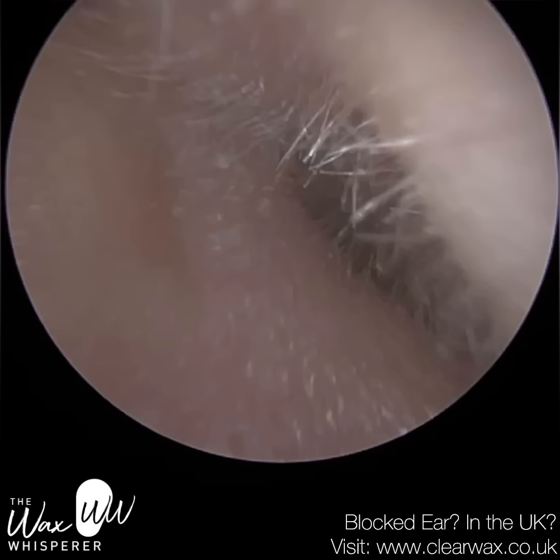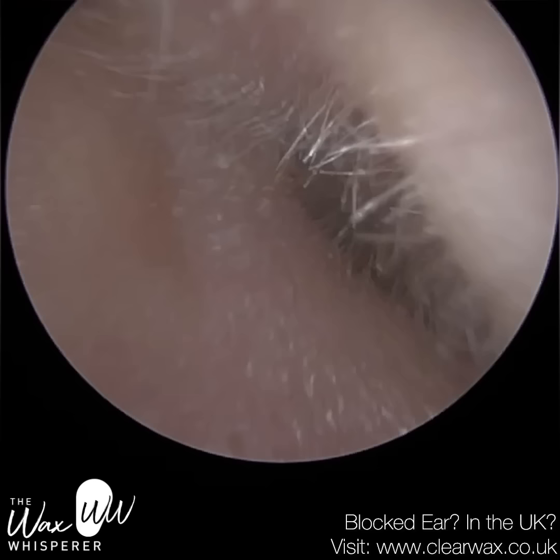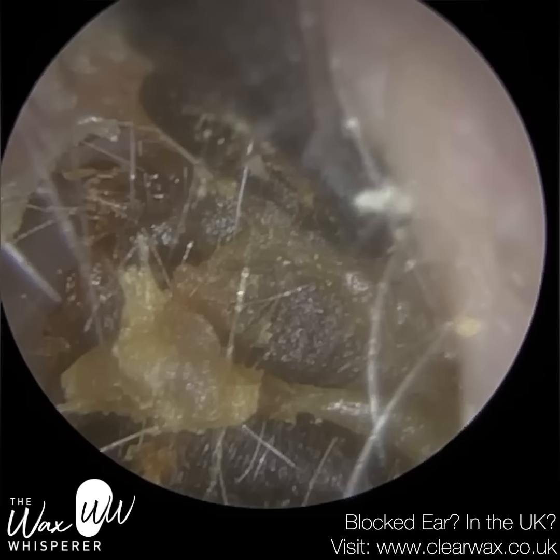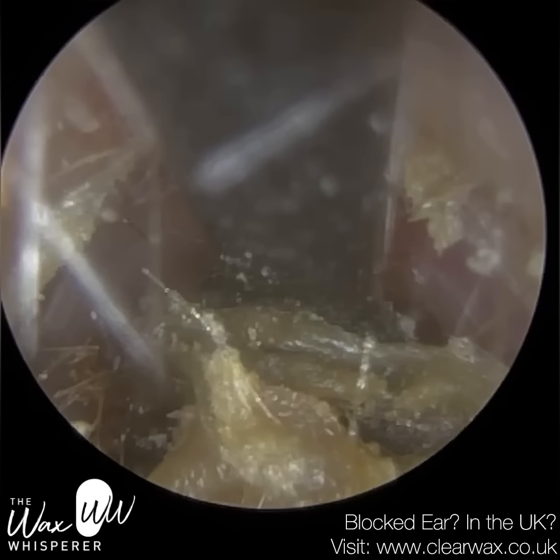Secondly, the distal end — the end of the instrument — is more angled inwards. Think about the geometry of a spade: it's got more of a narrowed tip. And I feel that allows me to glide a lot better, as you can see here, in between the keratin plug and the canal wall.